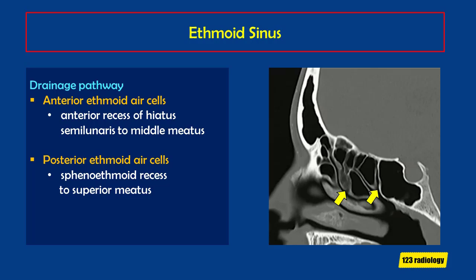The anterior ethmoid air cells drain to the middle meatus through the anterior recess of the hiatus semilunaris. The posterior ethmoid air cells drain to the superior meatus through the sphenoethmoidal recess. We can see that on sagittal images, with the middle meatus draining the anterior ethmoid air cells and the superior meatus draining the posterior ethmoid air cells.